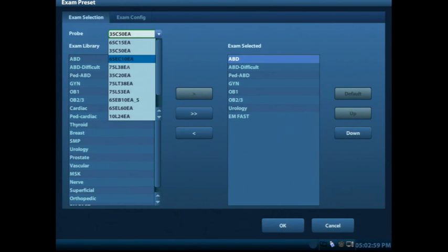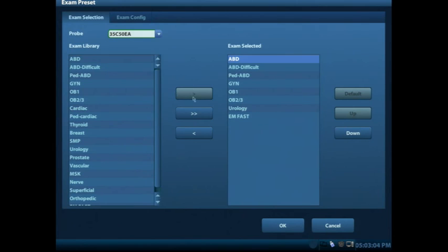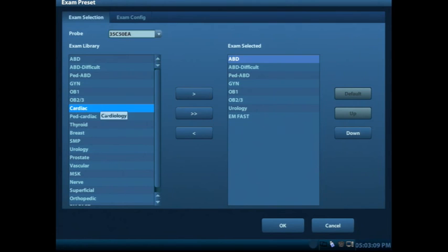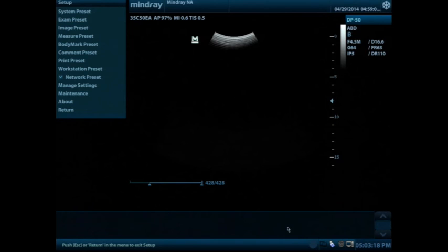You have the ability to look at the exam menu and pull things on and off based upon what you might be using the machine for by these arrows, the single arrow moving one of the selections over and the double arrows moving both of them back and forth. Again once changes are made, you want to go ahead and select the OK button here on the bottom to save those changes.